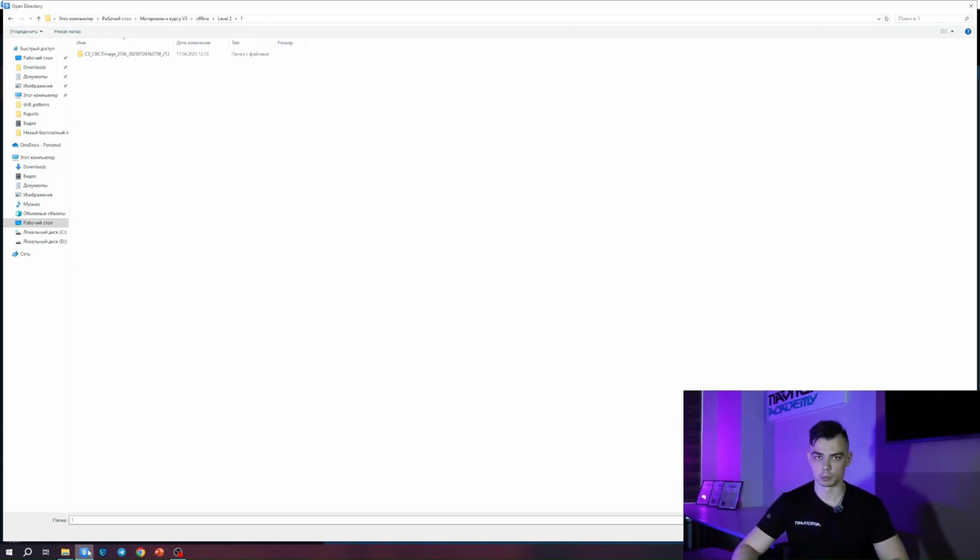Later on, when we start working in the software, I'll explain our approach, how we work with Edentulous jaws, because that's important. It's not just the technical skill of using the software and doing everything correctly, like placing things the right way. That matters. It's also important to understand the algorithm itself, meaning the clinical workflow, what comes after what, and what is needed at each step. Without this understanding, you won't get anywhere. But as I said, for now, just follow along with me.